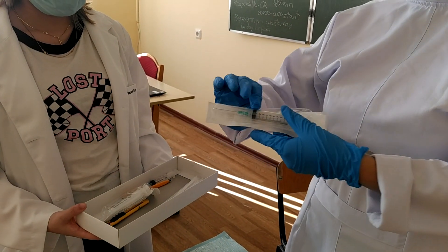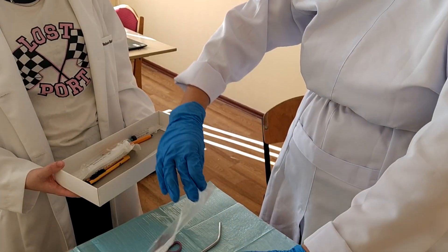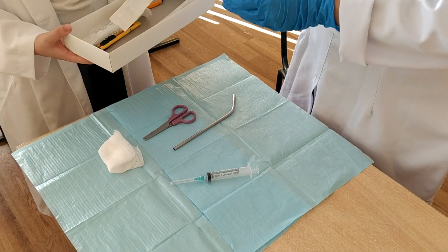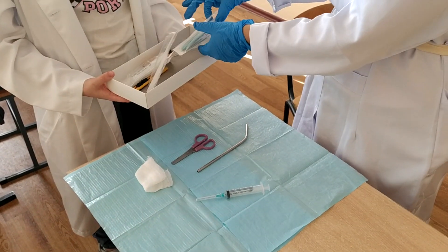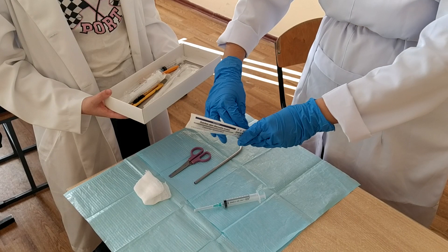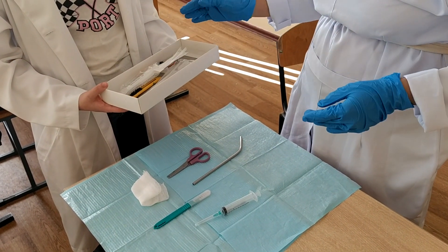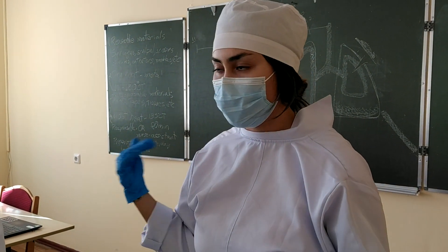They are in a closed package, and you will open it and just drop it on the table. That applies to all sterile things — this one is also closed and sterile, so you will open it and drop it on the table. That's all the surgeon will use for now; if he needs anything else afterwards, he can ask the nurse assistant to bring it to him.